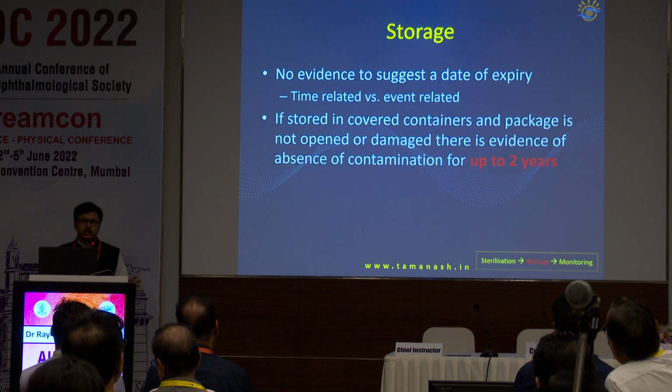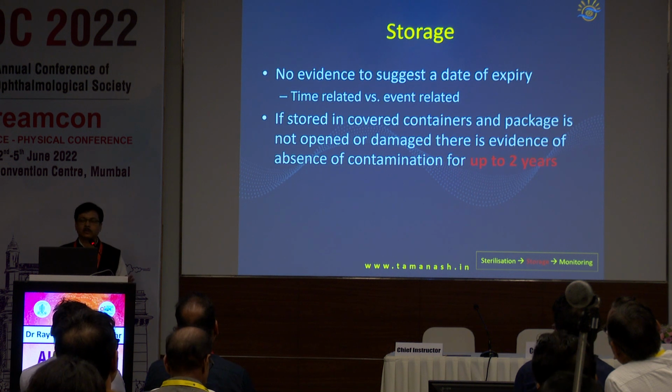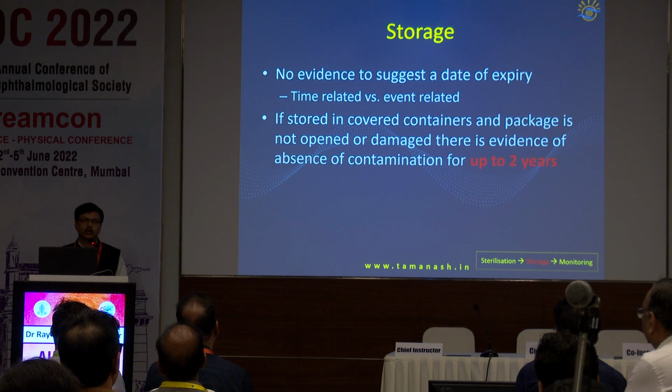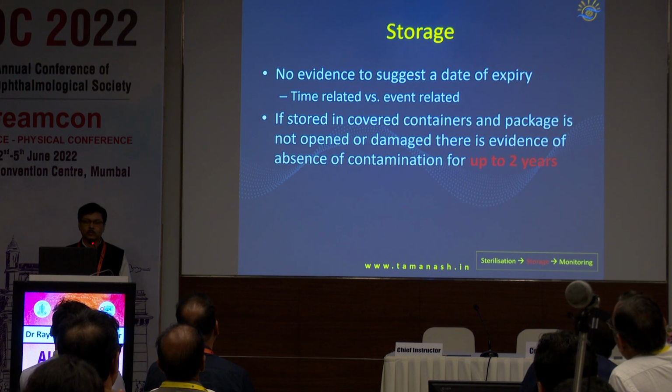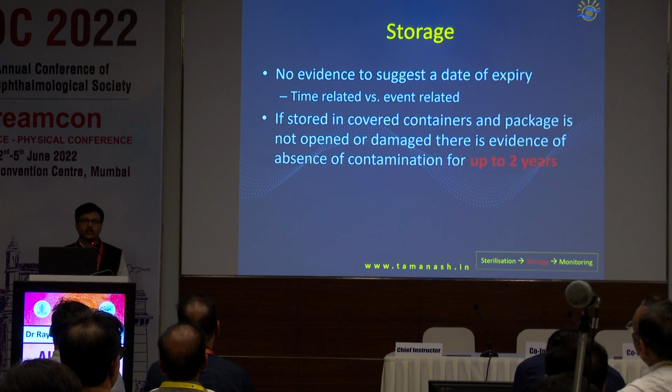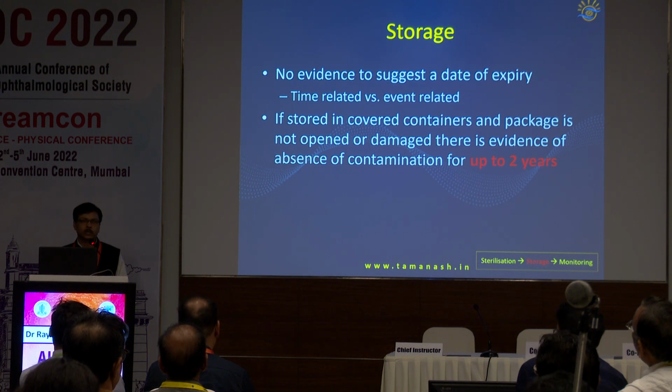Do they have an expiry? 2 years, 3 years, 5 years? Review of the literature says that there is no concrete evidence to suggest that once an object has been sterilized and properly wrapped and stored properly, is not wet or has not fallen, or the outer wrapping has not broken, then there is no upper limit to how long it will be sterile. And studies have shown that even up to 2 years, they maintain their sterility. But in common practice, we do not do that. For all autoclaved items, a maximum of 48 hours is the generally practiced norm. Although if you ask me for the source, there is no source, there is no reference. It is just what is practiced in the clinics.